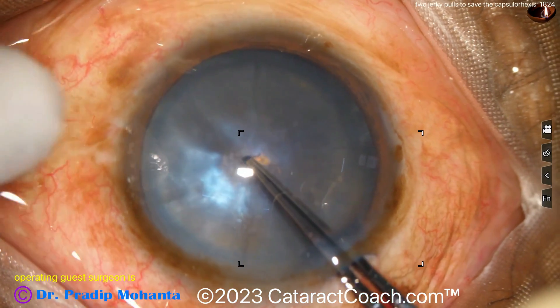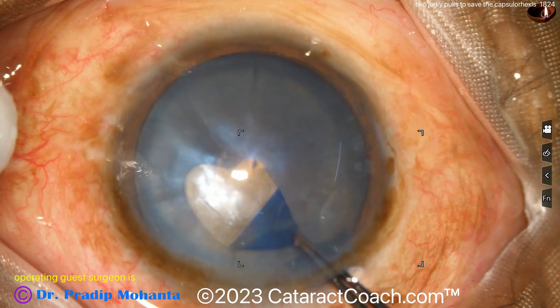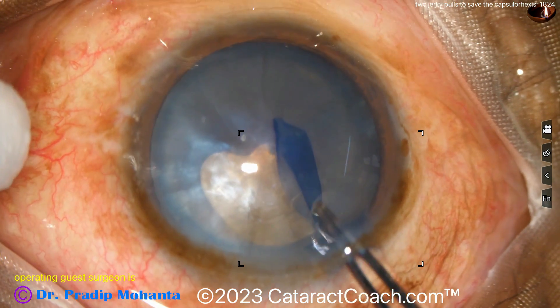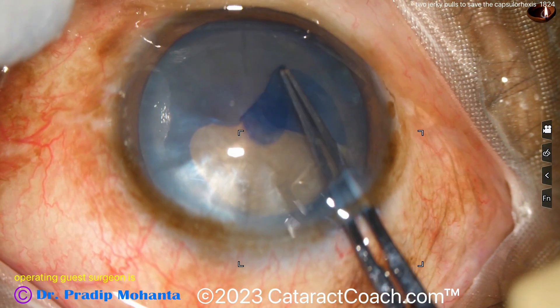Let's watch it in slow motion. Incising the capsule here with the forceps to start the rhexis, grabbing that, and as the rhexis turns here, you'll see it wants to run out. As it starts to run out, it's going to grab the capsule and go right out to the dilation support.